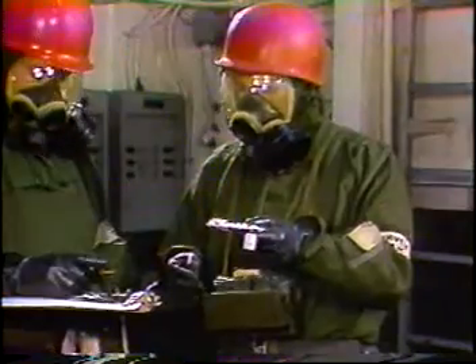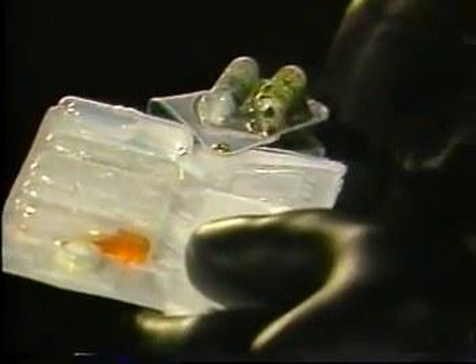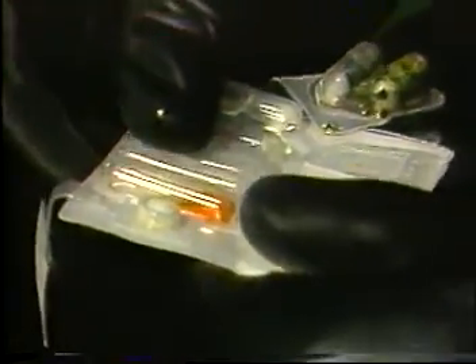Since the specific time periods are critical, use a stopwatch for all test sequences. When the two minutes are up, swing the heater away from the blister agent test spot and swing the protective strip away from the blood and nerve agent test spots, so that all test spots are open and exposed to the air.